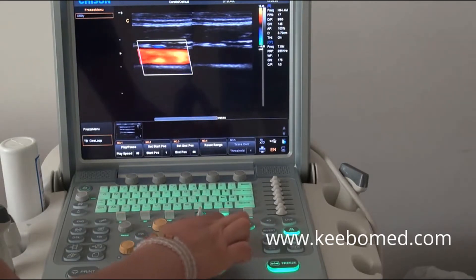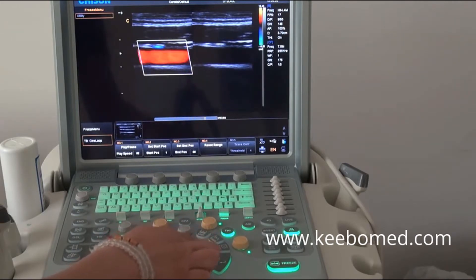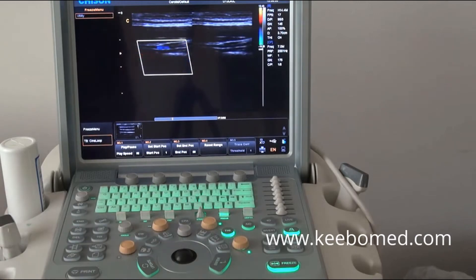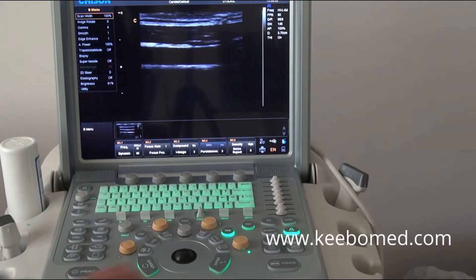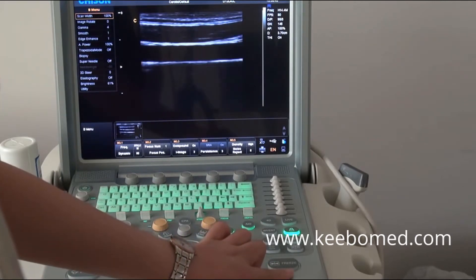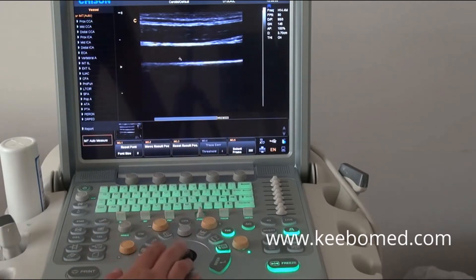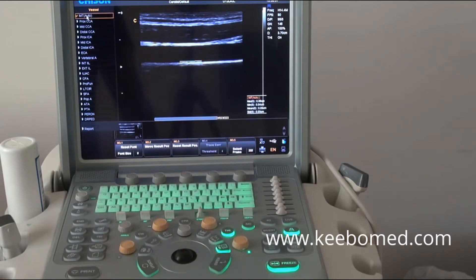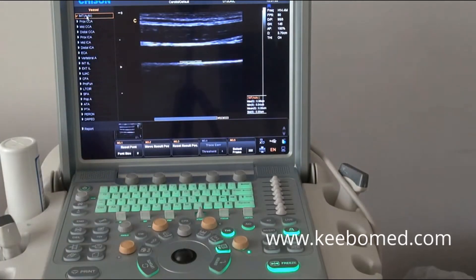Also, for this control panel, this is the measurement area: this one is distance, this one is trace, and this is the calculation package. For the intima-media thickness measurement, you will find the maximum, minimum, and mean value can be displayed at the same time on the screen.